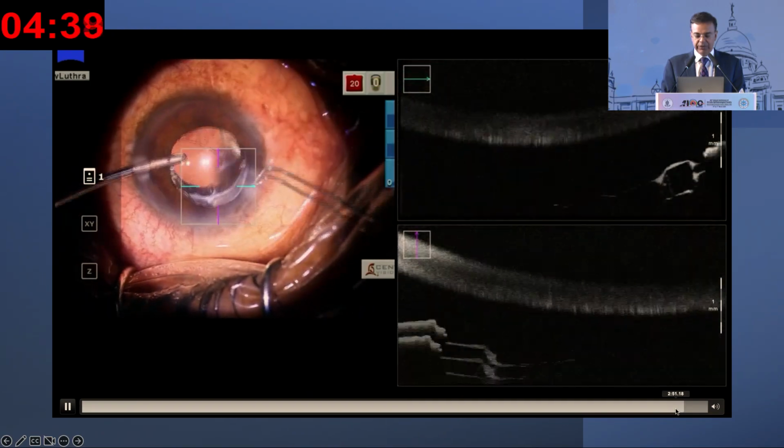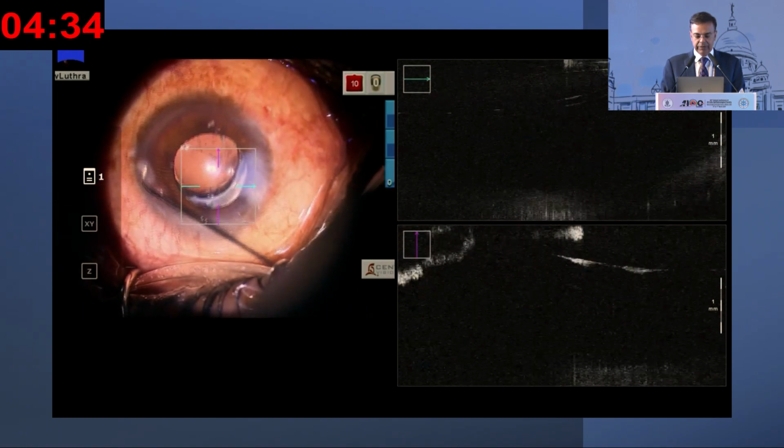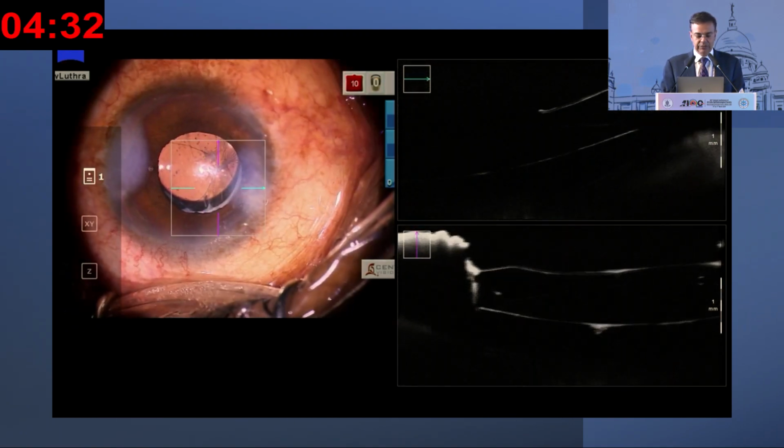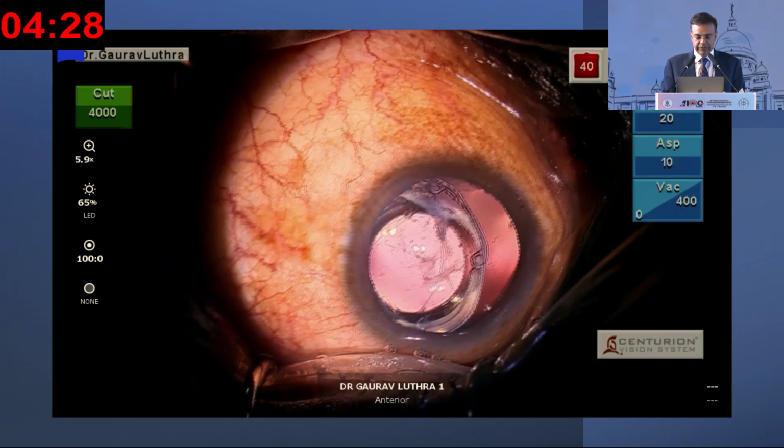and in the end I do an OCT to see whether the optic is well aligned, and maybe put a little bit of pilocarpine and see if it centers well and the posterior capsule is clear in the middle. It looks good in the end, so that's how we leave it.